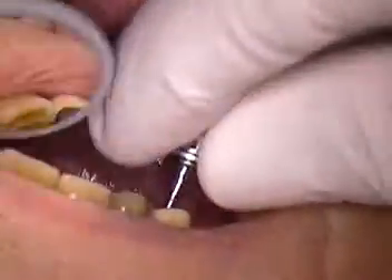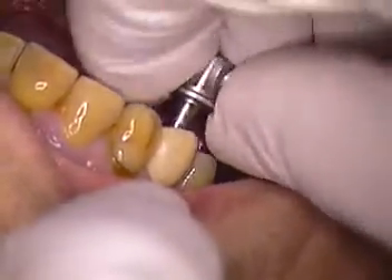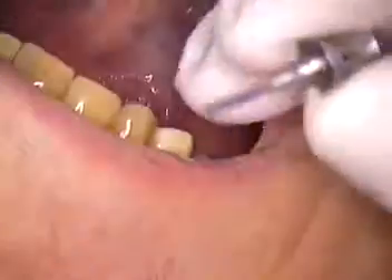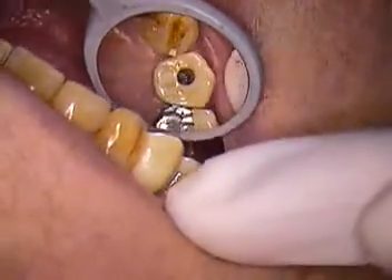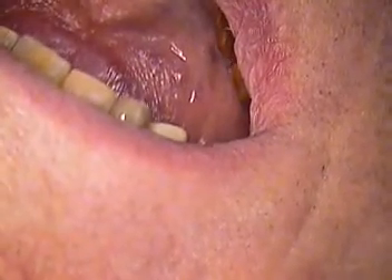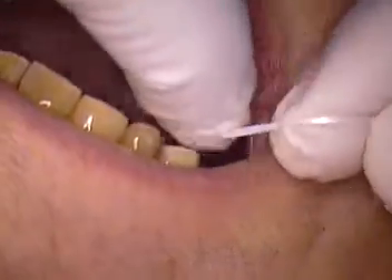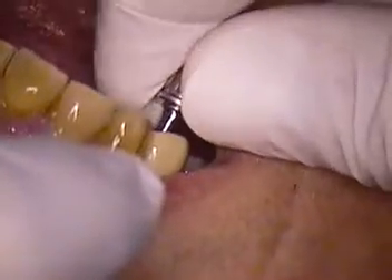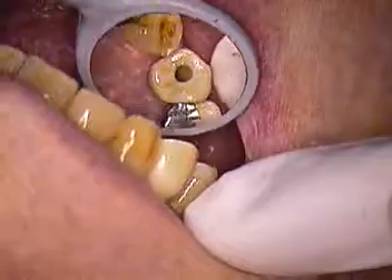Soft tissue sometimes will spread a little bit. As I hand tighten, you'll feel a little pressure build up in the soft tissues. How are you doing, Richard? So then we recheck the contacts. Now I'm feeling a little tightness on the mesial and distal, but it doesn't shred the floss, so that's good. If it did not floss through, then we would have to lighten that contact area. I'm hand tightening again — I'm not bottoming out yet. I'm getting a little bit of resistance from the soft tissue, which is normal.